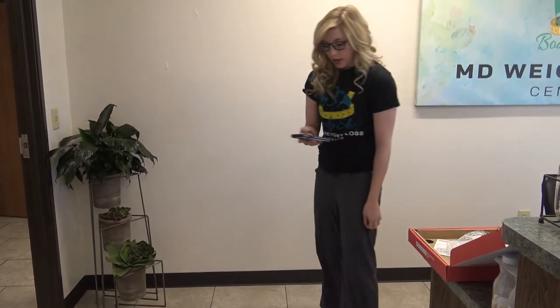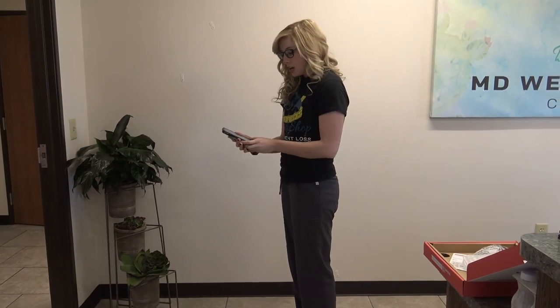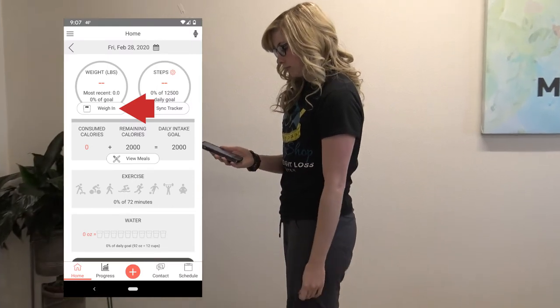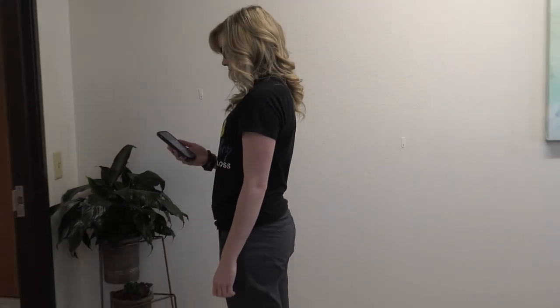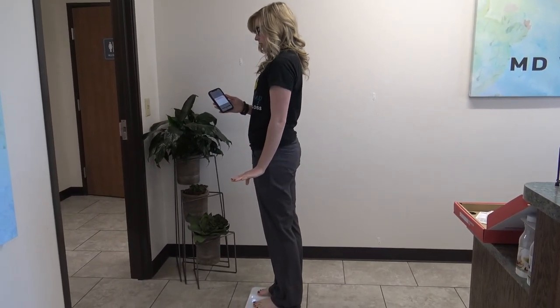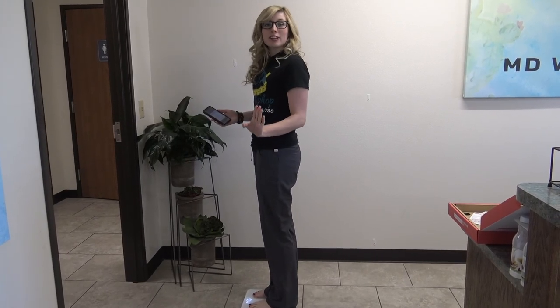We are going to open up our Body Shop app. You'll be directly there — just press 'Weigh In.' You're going to step up on the scale. It's calculating now, and it sent me your measurements. That's all you have to do.